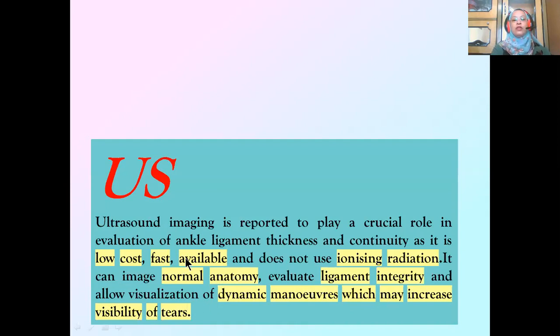So no need to delay utilization of ultrasound to evaluate for lateral ankle injury or lateral ankle sprain till 6 to 8 weeks after sprain, as this may be converted to chronic lateral ankle injury or sprain with its complications. So it's better to start early by ultrasound evaluation to have an idea about the injured structure.